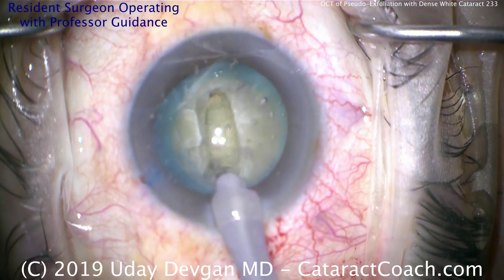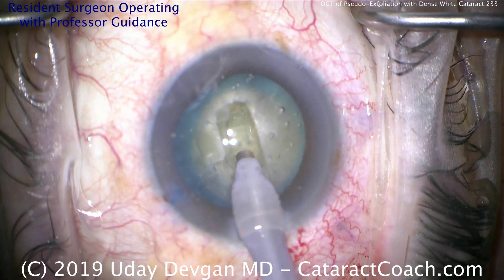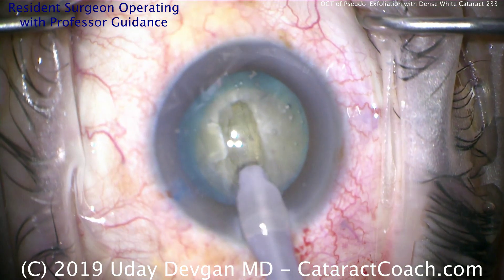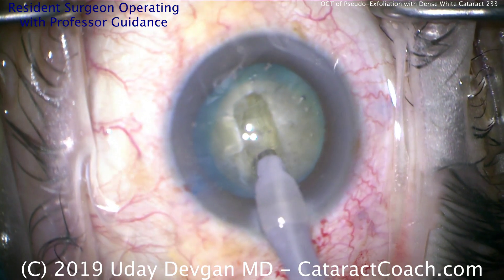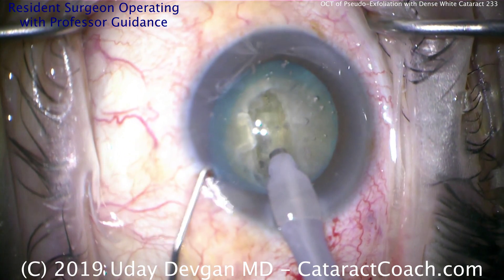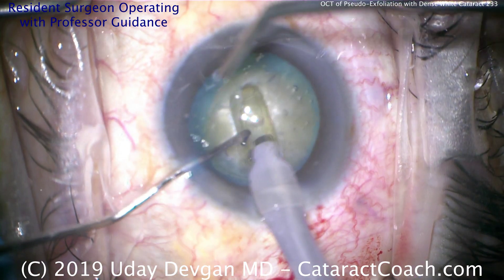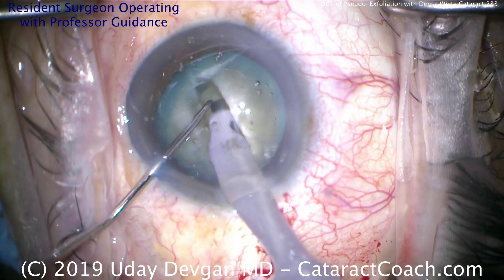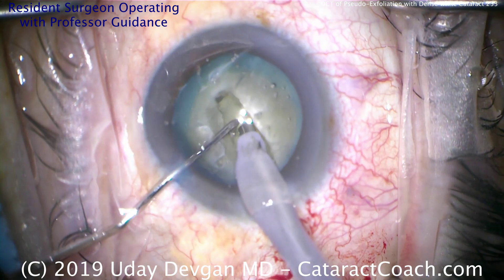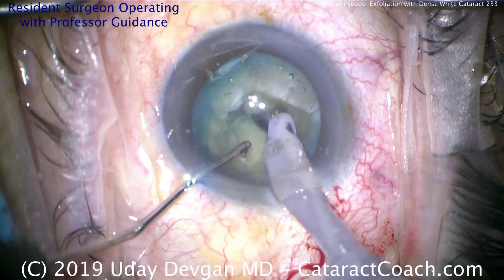A little more grooving there — looks pretty good. One final groove down the middle, and then we'll use the chopper to split the nucleus into two halves. Another advantage here is we're putting the phaco energy away from the central corneal endothelium — in a case like this with a dense nucleus, there's going to be more phaco energy used. Here comes the chopper going in the eye. We're going to crack the lens nucleus into two halves — pushing apart. Notice how both instruments are deep in the groove — that's very good form.